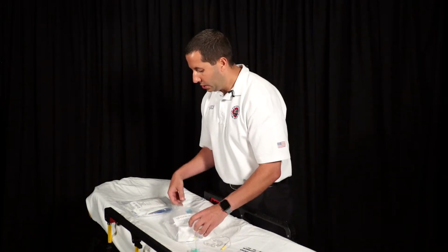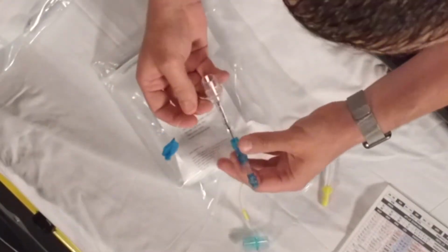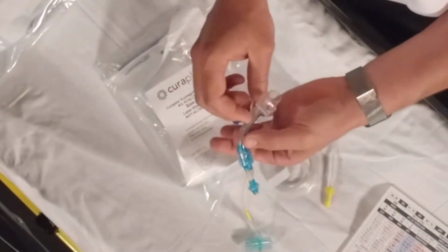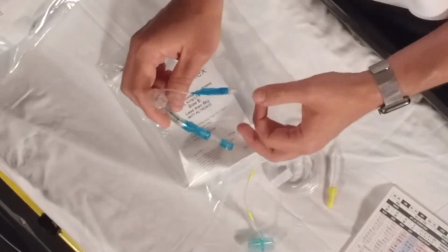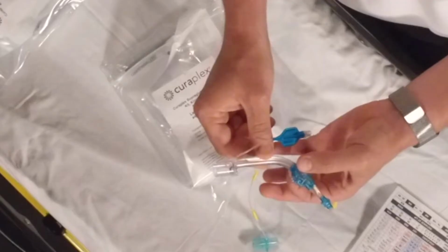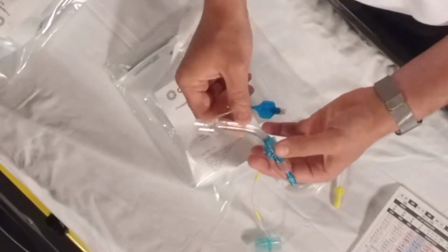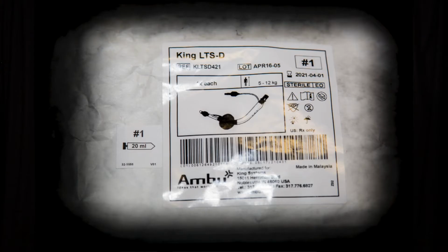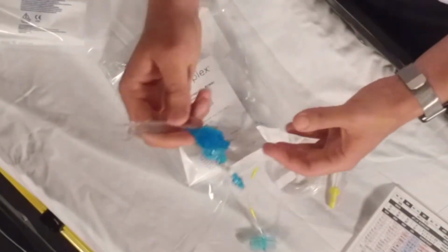Some other considerations to take into thought when opening this piece of equipment. This is your size 0 tube. As you're going to see, there is no inflation rate on the tube itself. You've got to look at that on the individual package. I'm going to utilize the size 1 just to show you exactly what I'm talking about. This is going to be your inflation ratio or your inflation volume. So as you can see, 20 mLs. For the size 0, it's going to be 10 mLs of air.